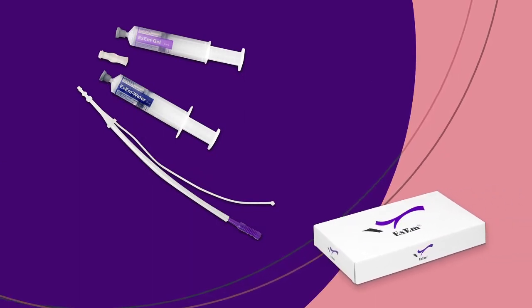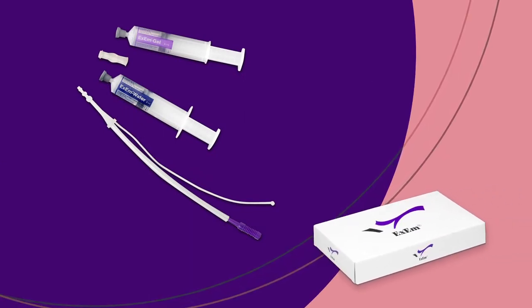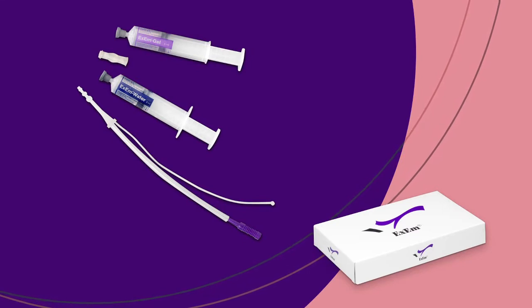This film is about ExEm Foam Kit, a simple way of assessing tubal patency by means of an ultrasound scan.